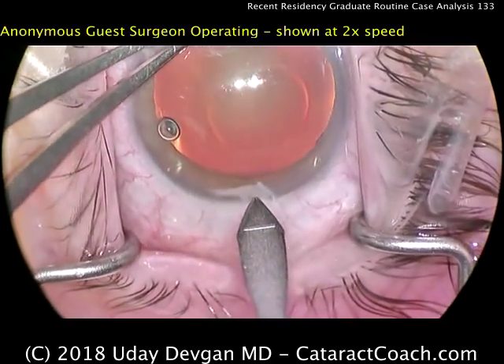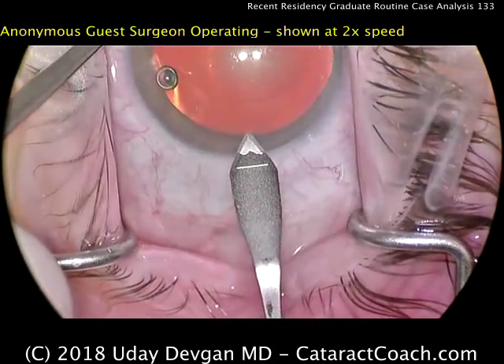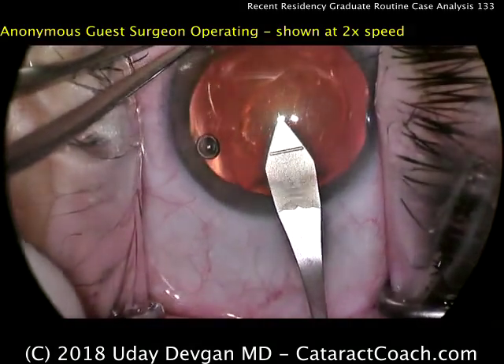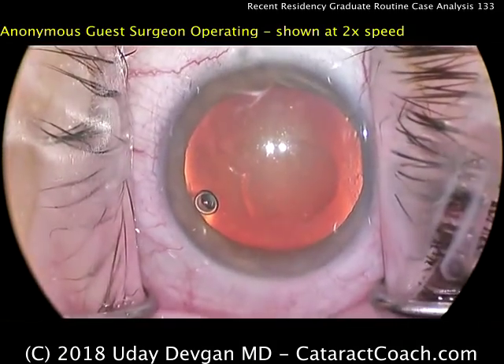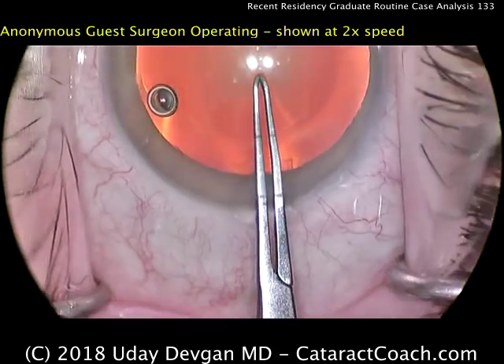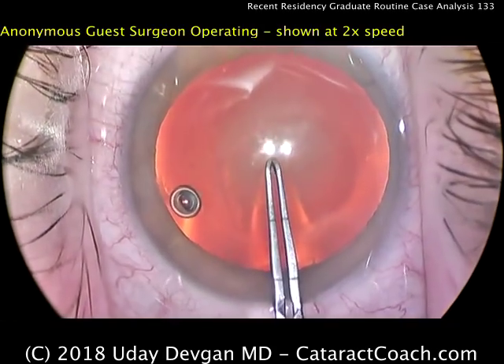Let's take a look here — looks pretty good. Good tunnel length. I like it. This video is shown at twice the normal speed so that we can be efficient in our analysis and evaluation here.